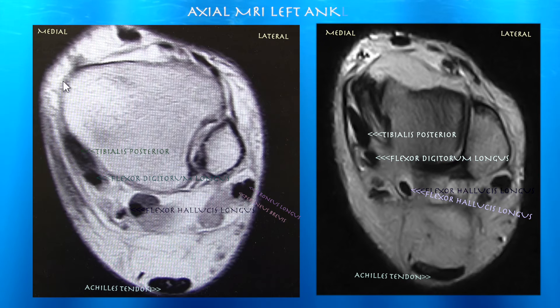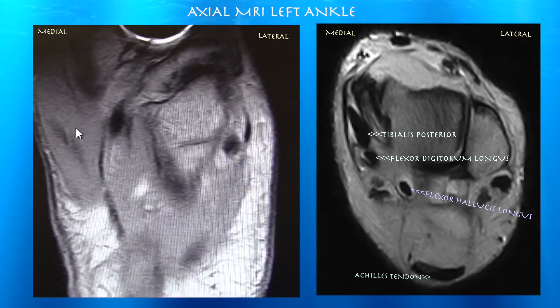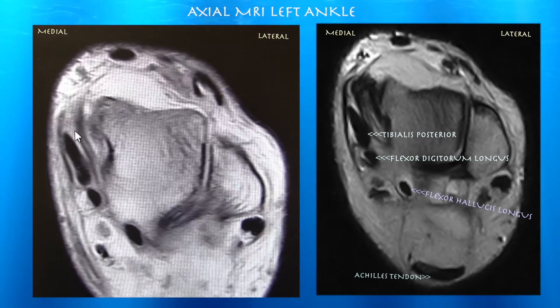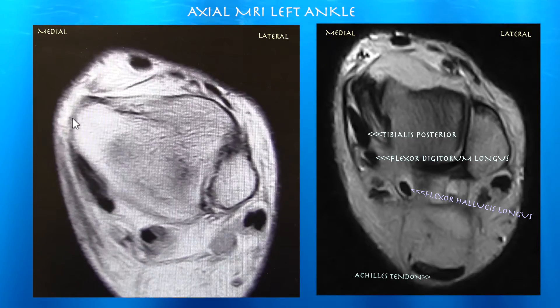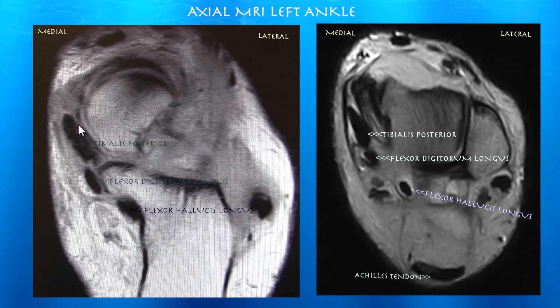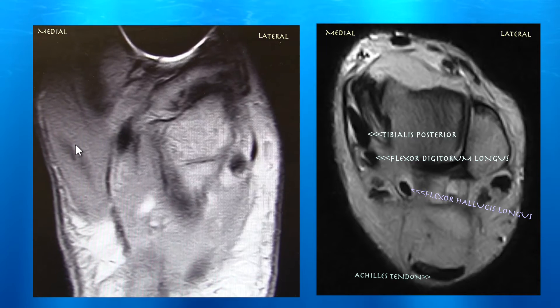Here's his MRI that he presented with. You can see the tibialis posterior tendon is enlarged and there's some fluid around it. MRI of the left ankle — you can see the swollen, very enlarged tibialis posterior tendon. Typically it could be twice the size of the flexor digitorum longus tendon, but in this case it's about three times bigger, or perhaps even four times bigger, consistent with swelling and tendinosis.